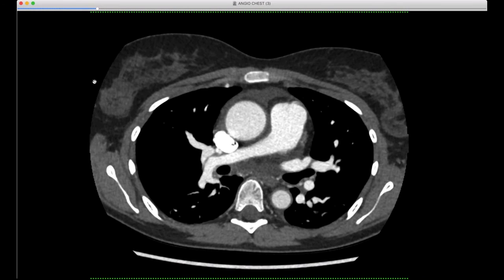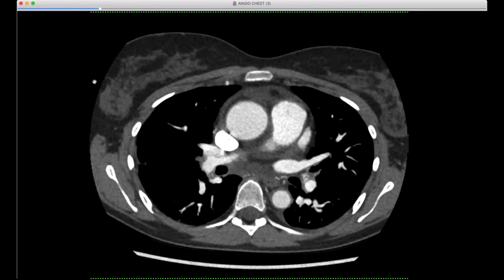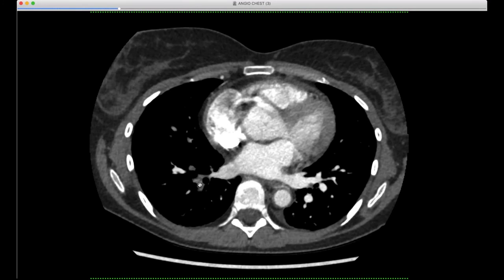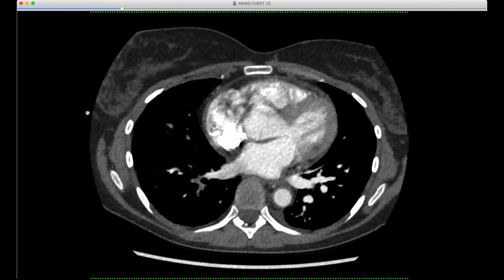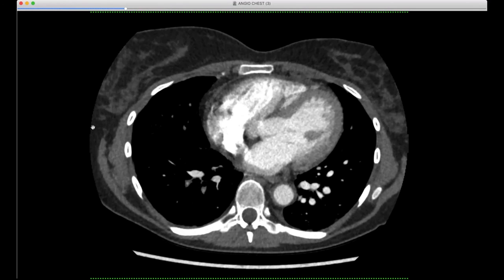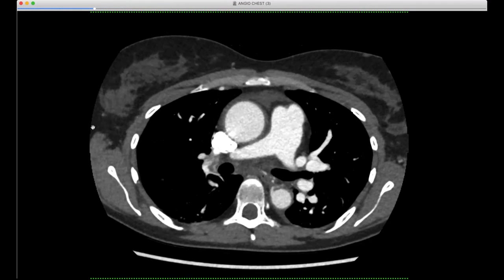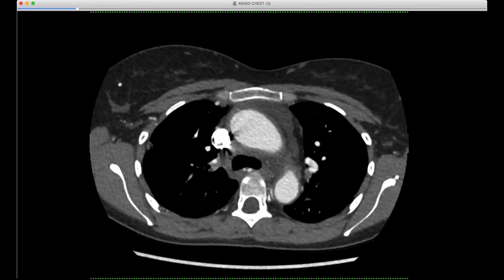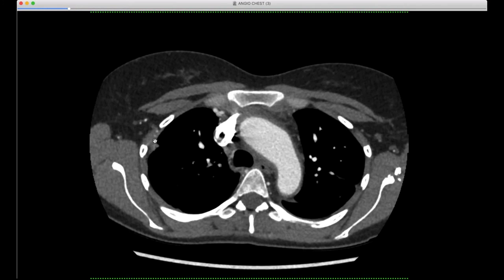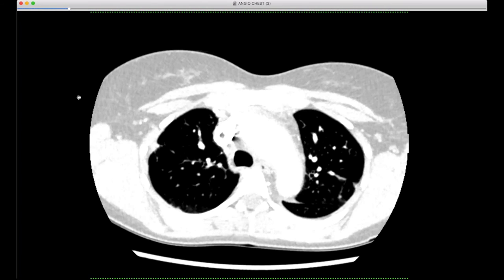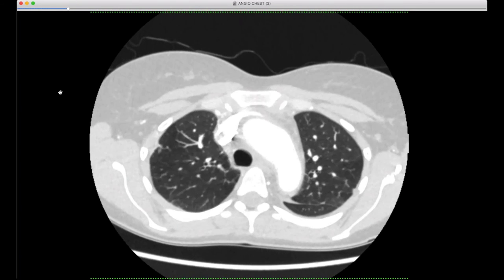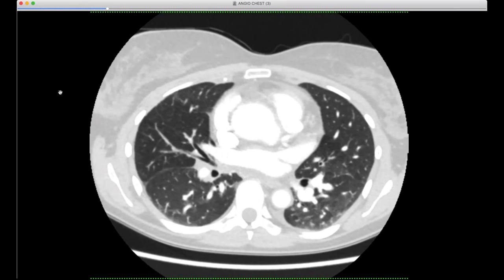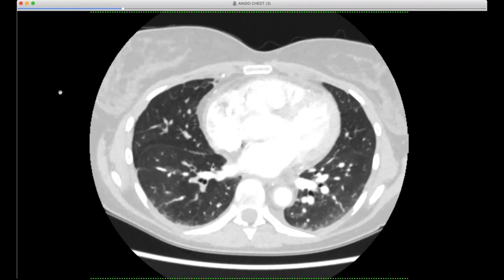You can see this long segment of the right main pulmonary artery is abnormal and stenotic. Getting into the lower lobes, there are multiple areas of occlusion of the pulmonary arteries that would look just like chronic PE if you didn't have the rest of the case. Coming back up, you can see typical hypertrophy and dilation of the bronchial arteries as collaterals. You can also see up here in the right upper lobe sequela of a prior infarct. There's also some mosaic attenuation that fits with these chronic occlusions of the pulmonary arteries.